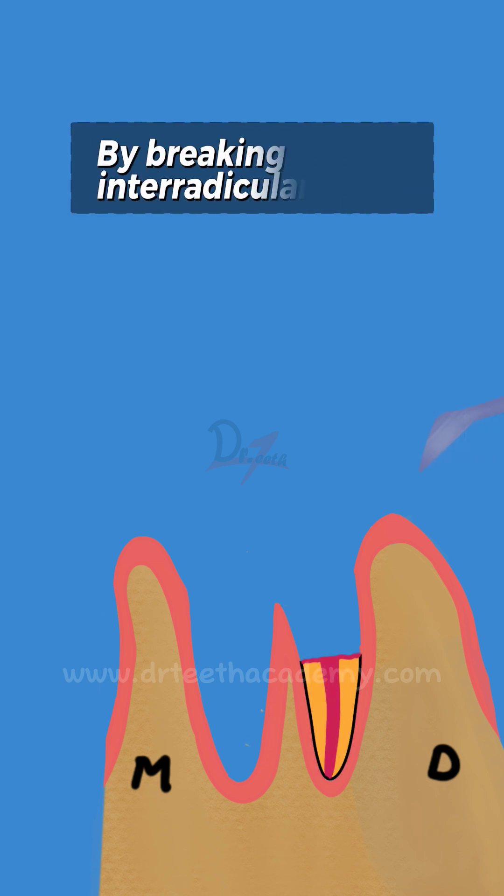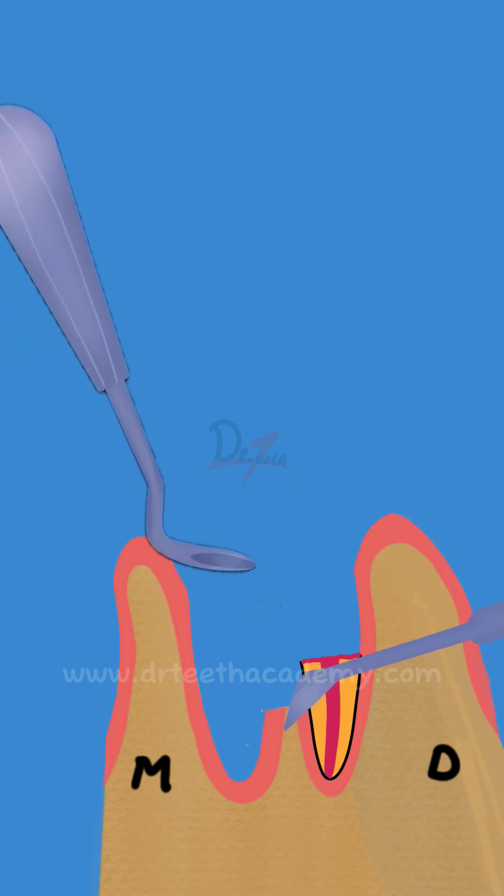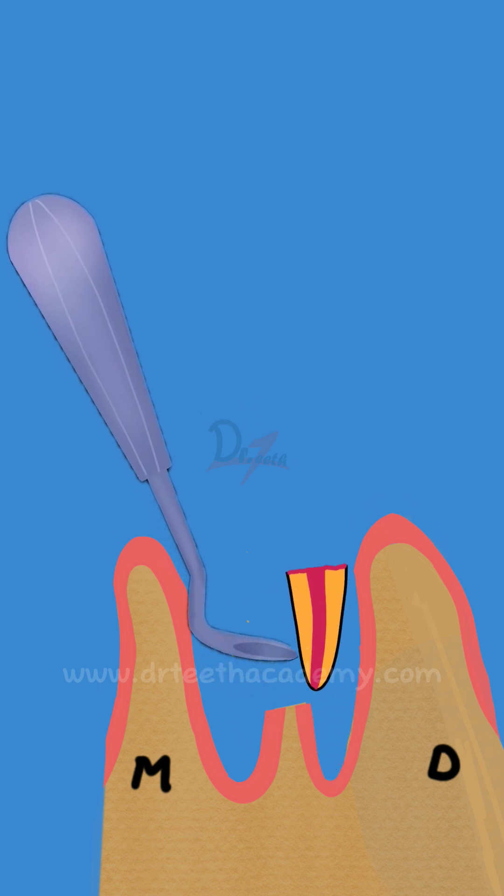Other method is to break the interradicular bone using a crier, so that we can remove the root piece from the socket of the other root. As you can see here. All right.